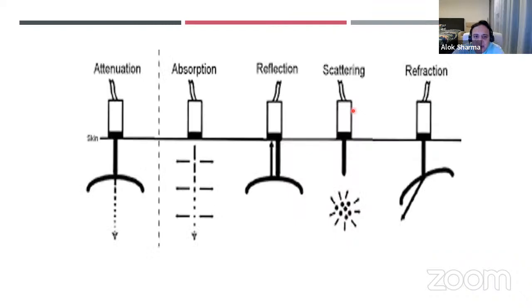The problem is that as we do ultrasound, tissues tend to absorb energy from the sound waves. And as the sound wave goes deeper, you get attenuation. The sound wave basically becomes less strong, and actually, reflections also become less strong for that very reason. A good example of that is A-lines.